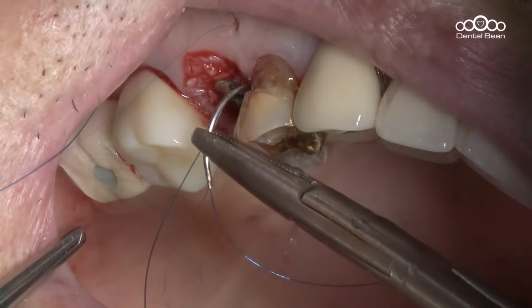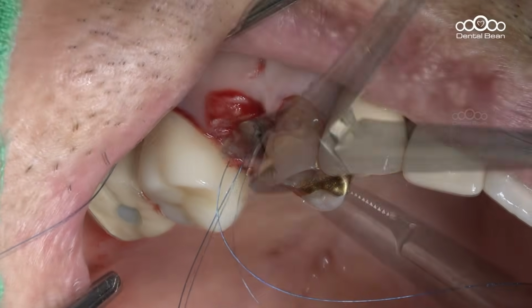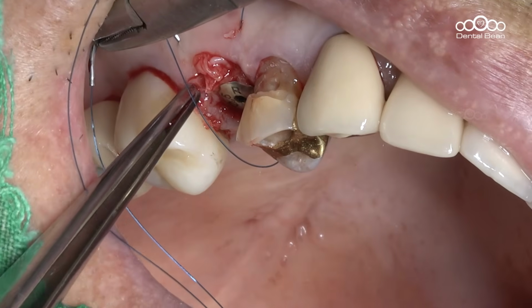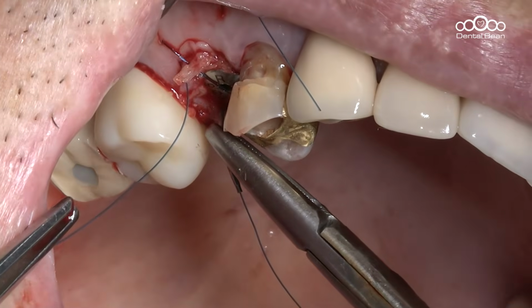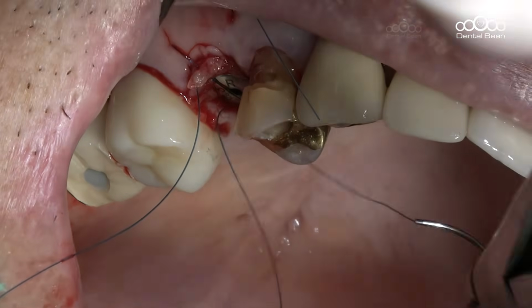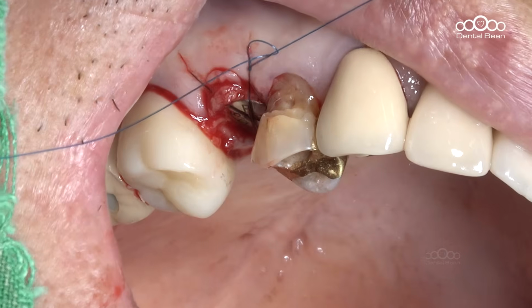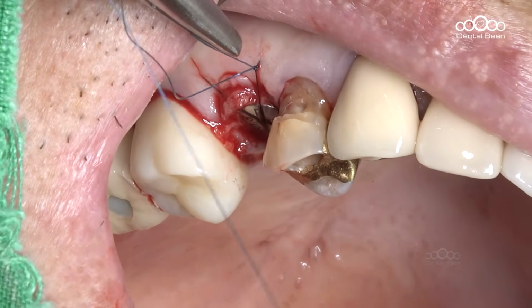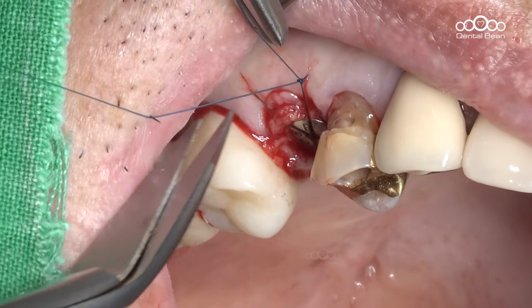A simple figure-of-8 suture is being performed to gently approximate the soft tissue and stabilize the surgical site, rather than completely sealing it. The suturing procedure was completed successfully, and the surgery was concluded.